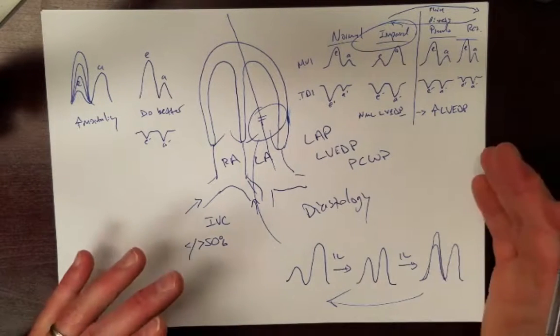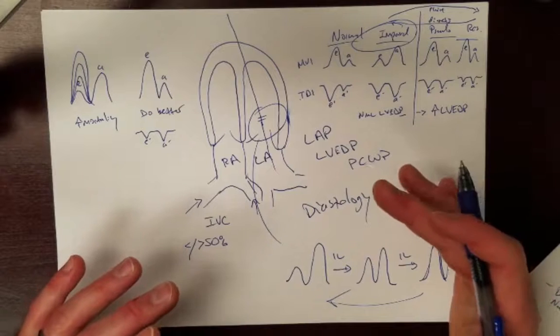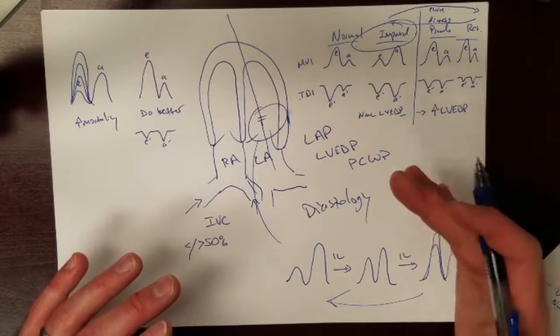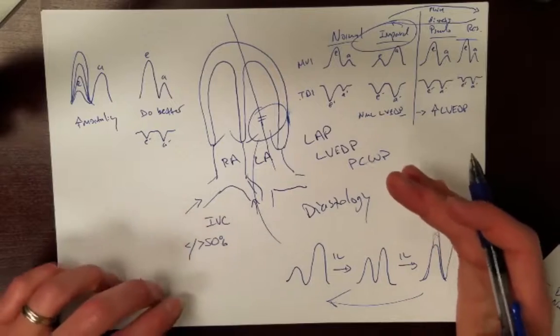The whole trick here is that you can't just use one ultrasound and determine what your patient's fluid balance is and how much fluid you need to give them. You have to do this multiple times. It has to be a fairly regular process.